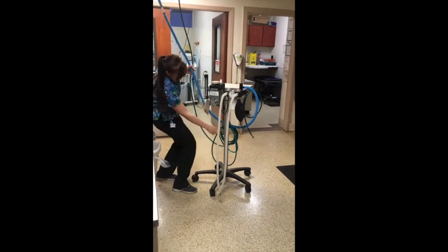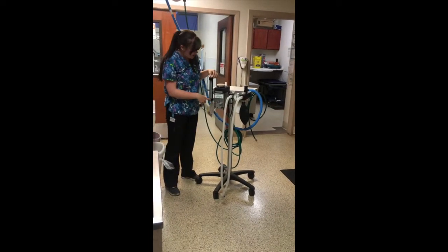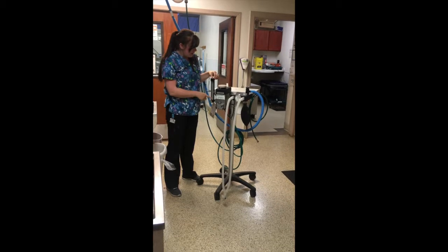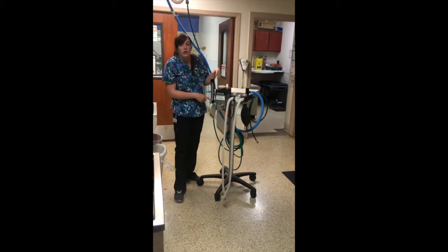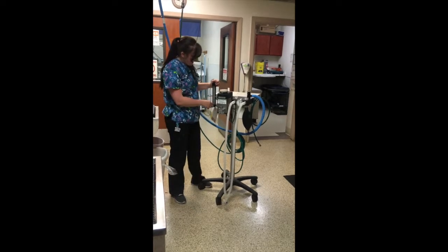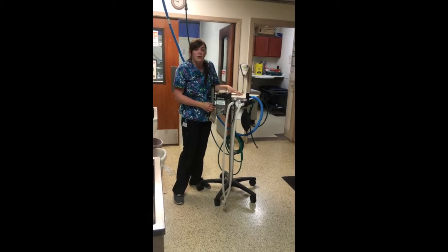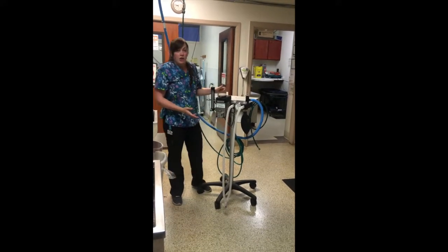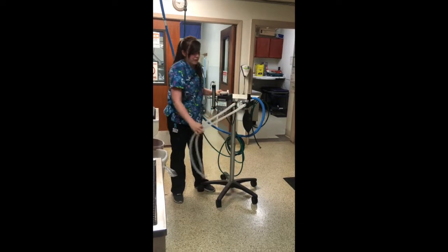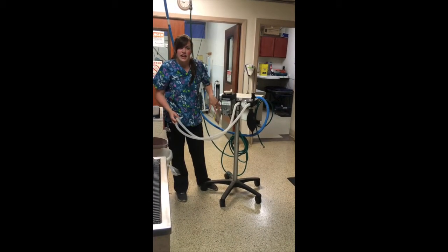Oxygen comes down, a couple times loops, comes up to our flow meter. So first off, the flow meter, you can turn the knob and deliver an appropriate flow. You can choose which flow rate you want to deliver your oxygen at. Then we have an O2 flush, which we can use if there's a ventilator attached, we could pulse it to fill up the ventilator. If not, if you have a patient that needs direct oxygen, you can flush your line of any anesthetic gases.